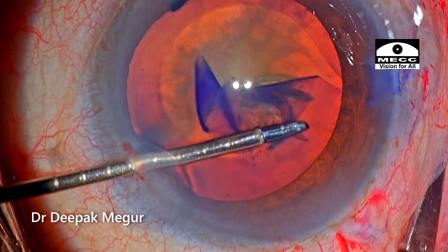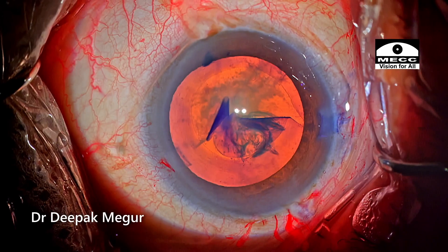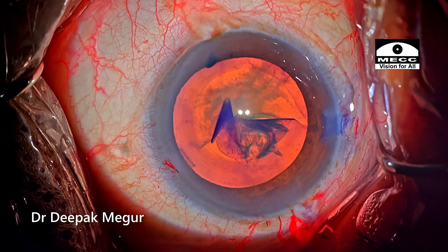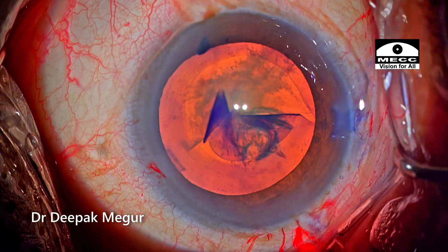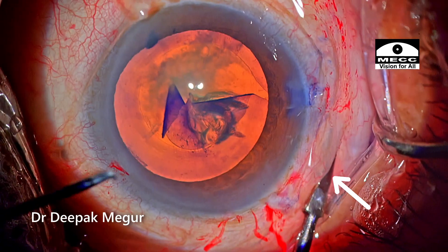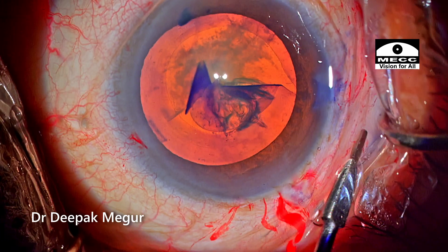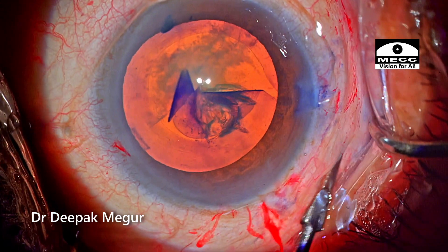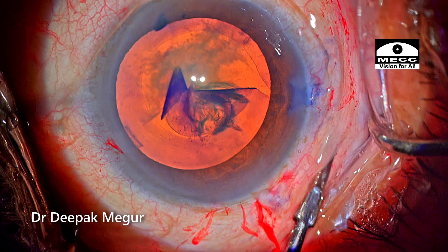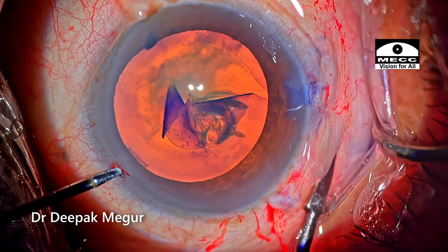I'm going to use micro forceps through the other side port, but before that I'm trying something new here. This is a technique which I read in some social media messages. I'm using a spatula-like instrument — basically a globe stabilizer which was in the tray — and I'm using this to depress the sclera in the pars plana region, exactly adjacent to the area where the tear has extended radially. The idea is to relax the zonules as the tearing process happens.